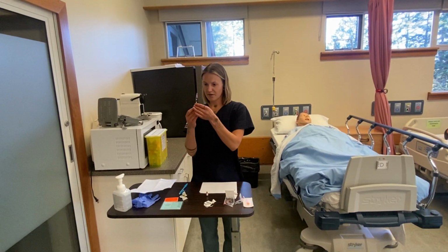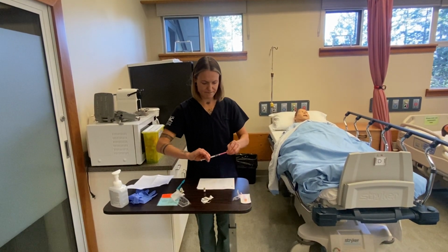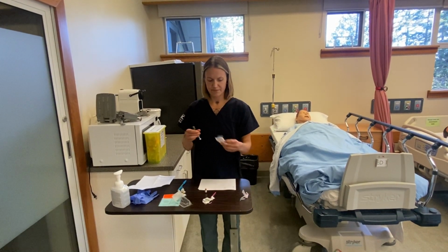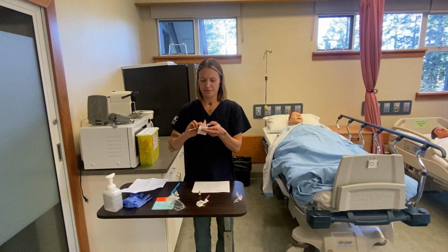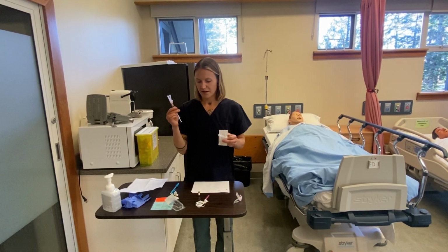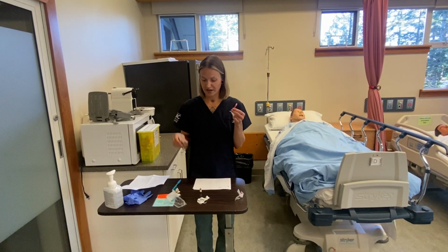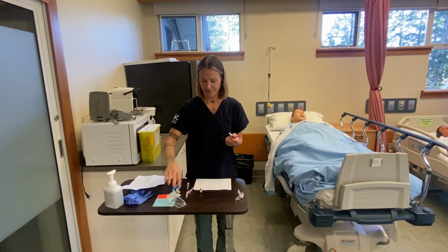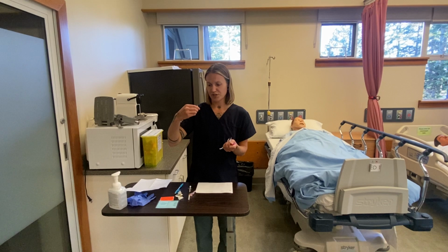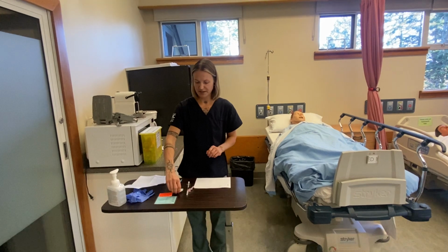Okay, and once I have the right amount, I will put the cap back on. I can take that off, and I can put on my injection needle. And then I will get rid of all the stuff and put it in sharps, and my third check will be just looking again that I have the right medication, which is morphine, and it's not expired. So that will all go in my sharps container.